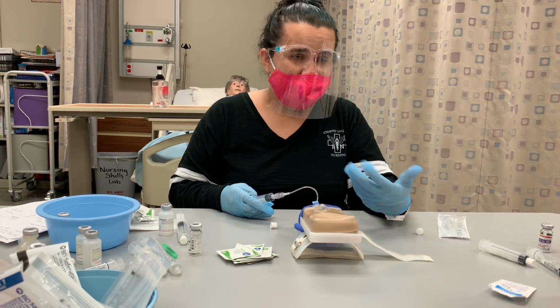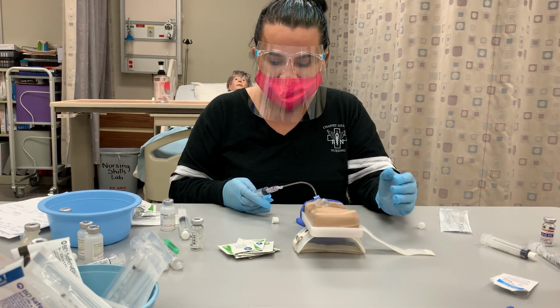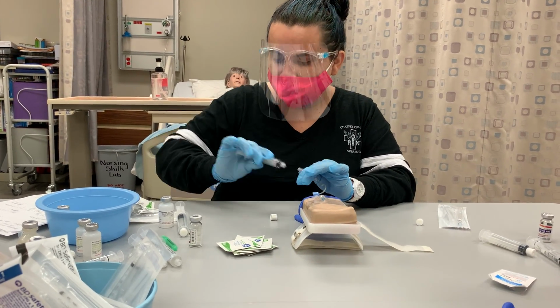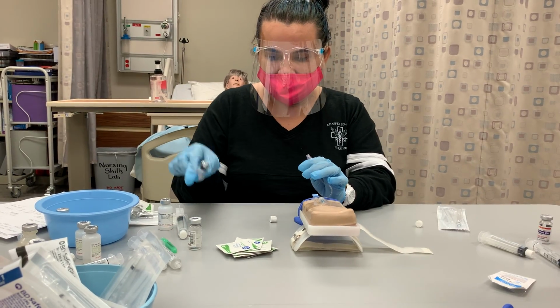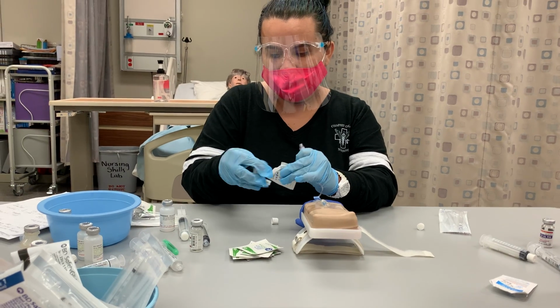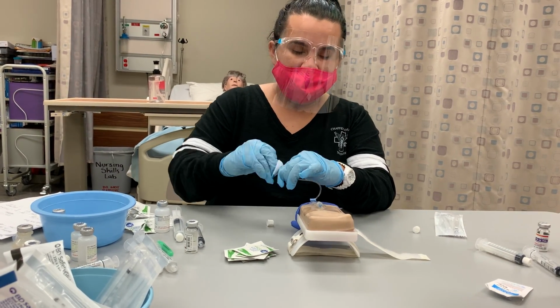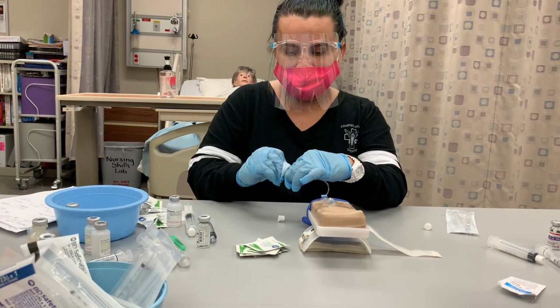Assessing the patient, how they're feeling, assessing their psychosocial status, or anything we need to assess, any concerns. Okay, so we would be done. We would discard of our medication. We would grab another alcohol pad. We would scrub again for 15 seconds.